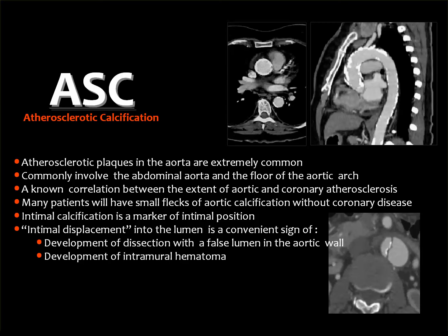Arteriosclerosis or arteriosclerotic calcification is a very common, or extremely common, finding in clinical practice. The calcium affects most of the aorta, but the most common site is the inferior border of the aortic arch, which is known as the floor of the aortic arch. Sometimes these calcifications are also associated with coronary calcification.